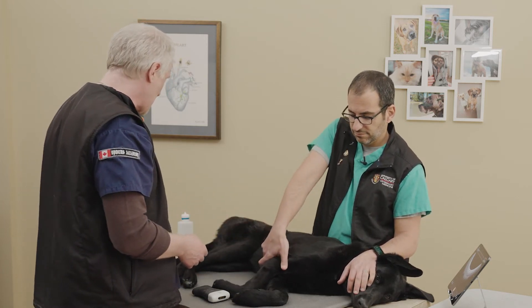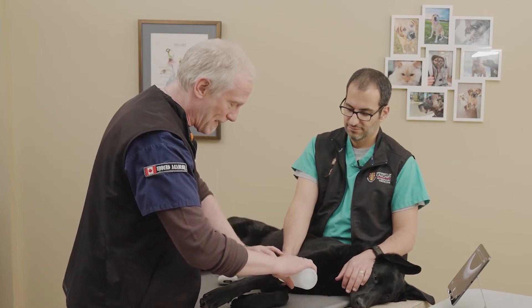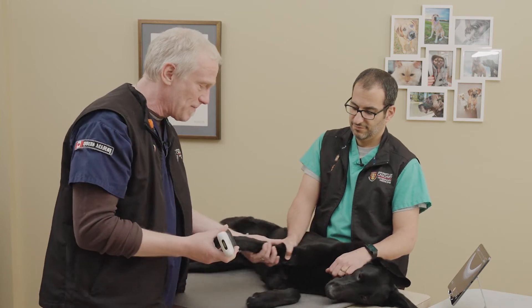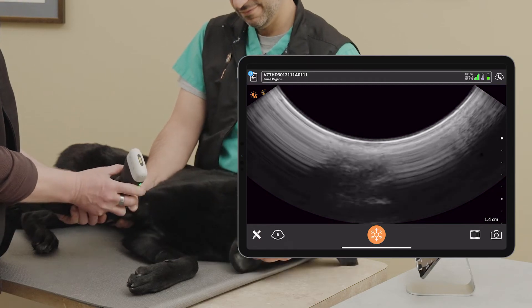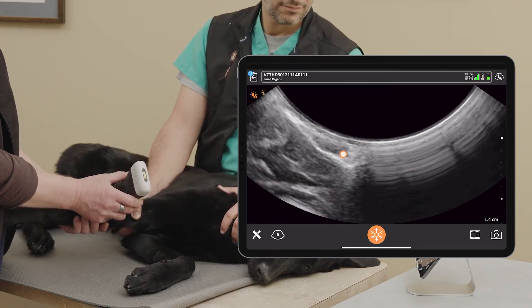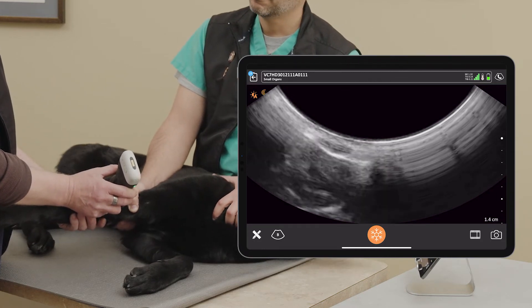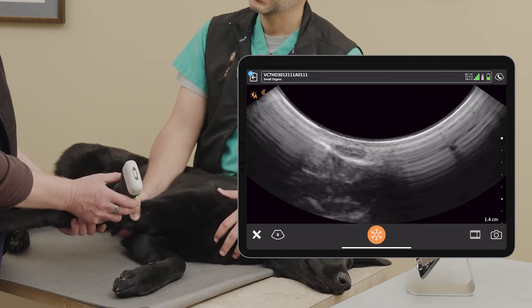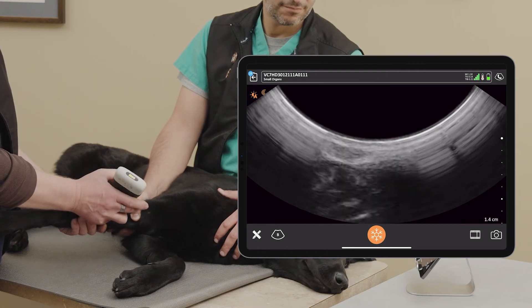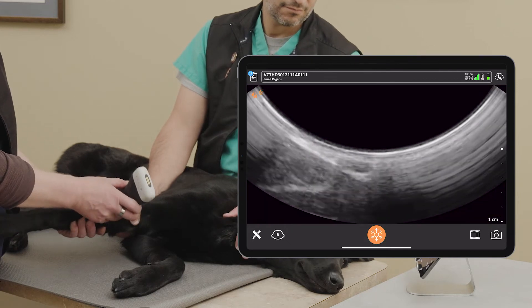The other thing we can do — if we've got a really edematous limb or animals like Sharpays that have very thick skin that makes it hard to see the vessel when trying to do a cephalic or saphenous — we can also use ultrasound guidance to help with that. Penny's a very fit dog so her vessel is going to be very superficial, which is more challenging to show, but especially with patients that have edema or very thick skin we can often find that vessel. Here you can see we've got a vessel on screen — that's our cephalic — and if I push down and collapse it, relax, I can see that cephalic vein. In short axis or long axis, if you're really good at long axis, we can often put a catheter in that way, but my preference is definitely short axis.